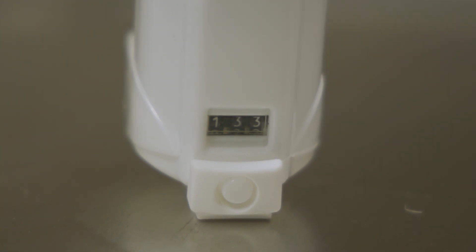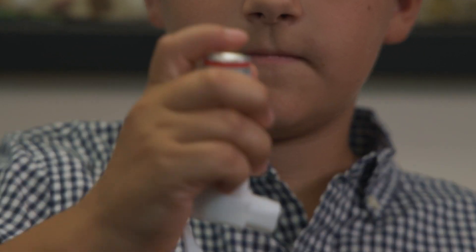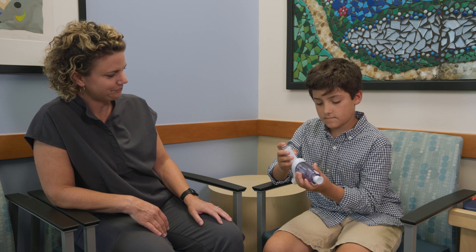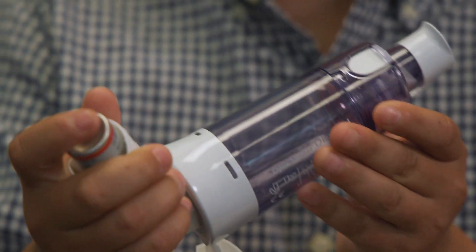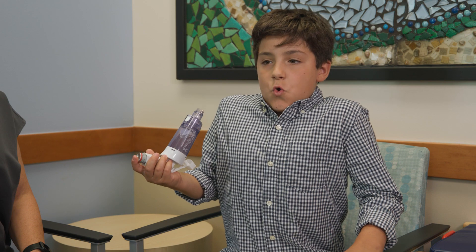Now the inhaler is ready to use. Let's go over how to do a proper treatment. Grab the inhaler, remove the cap, and give it a good shake three to five times. Place the MDI into the holding chamber, making sure it's all the way in. Be sure to sit upright or stand — this is the best position for the medicine to get to all of the areas of the lungs.